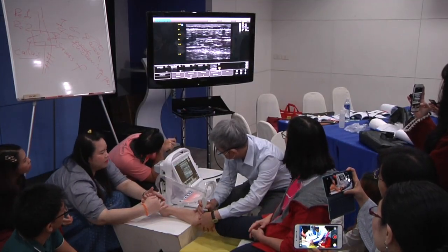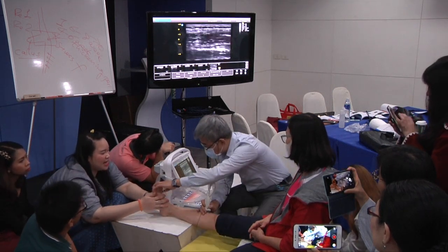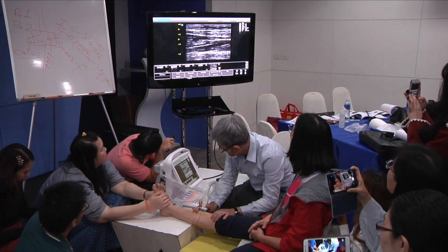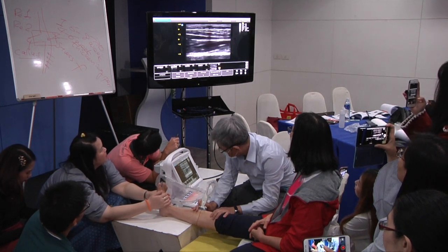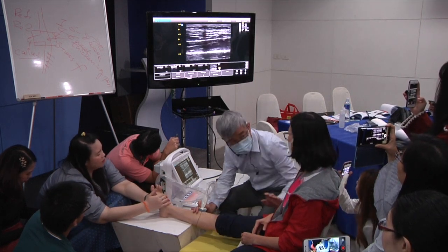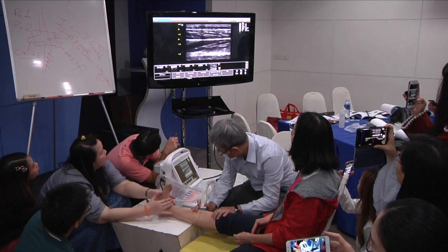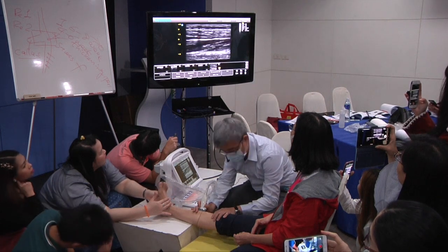Hold it, yeah. And start from neutral position. That is lengthening, yes. Because the tibia anterior was stretched, so the move is slightly different. Okay, this is good. Okay, dorsiflexion. Move backwards. Go, go, go, go. Go, more. Relax. Okay, slowly. Let's do it again. Okay, slowly. Dorsiflexion. Move back. Yeah. Go. More. Okay, relax. Slowly. Too fast.